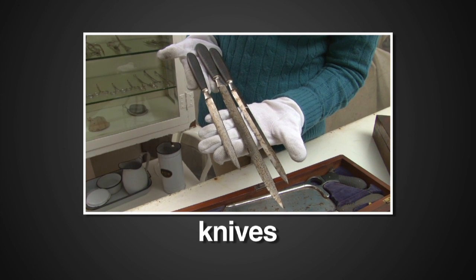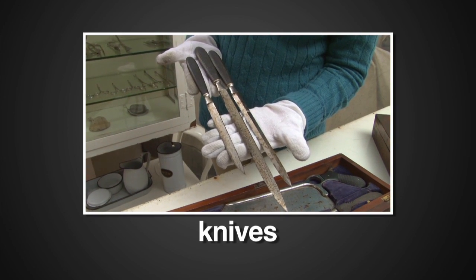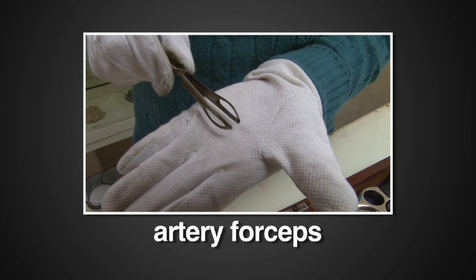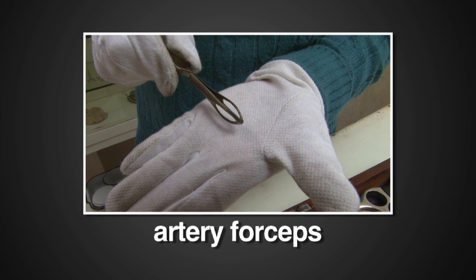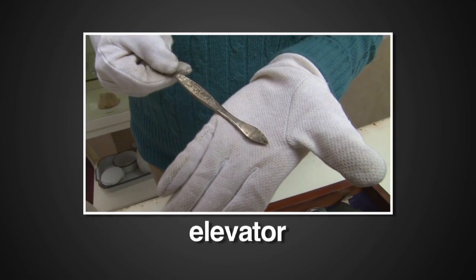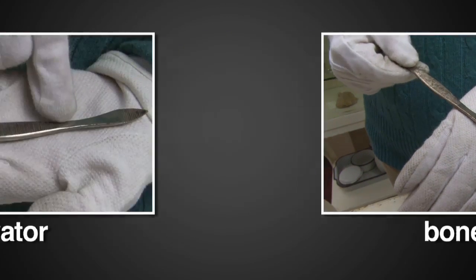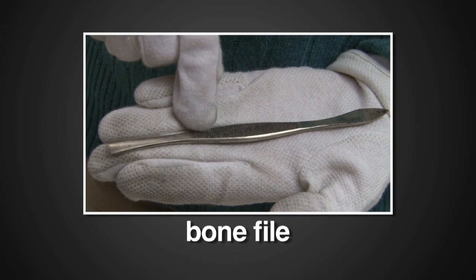An array of knives of different sizes used for soft tissue such as skin and muscles. Artery forceps used to clamp off an artery at the amputation site. Needles and silk thread. An elevator to lift small pieces of bone or other tissue. And a bone file to smooth the end of the bone after amputation.